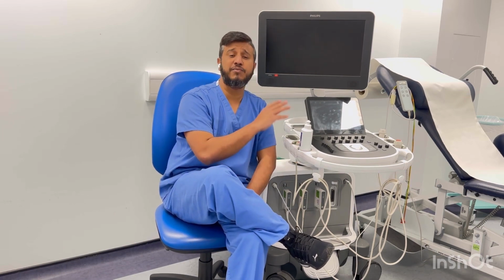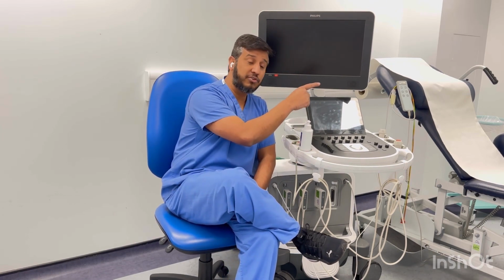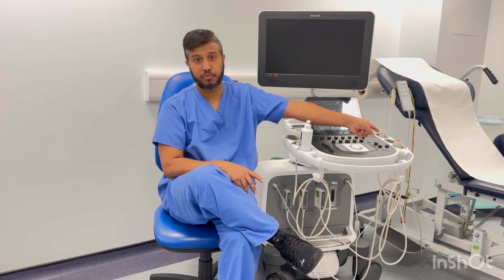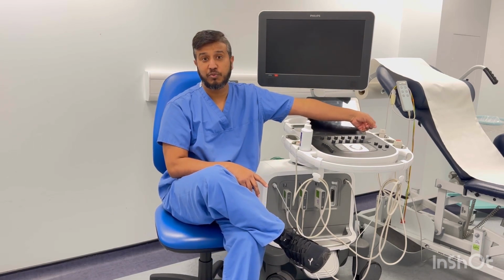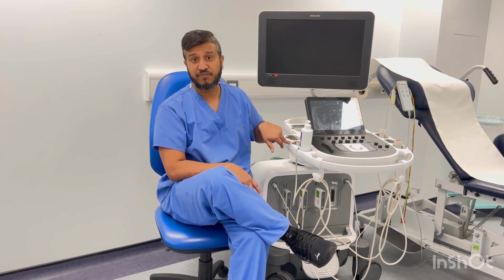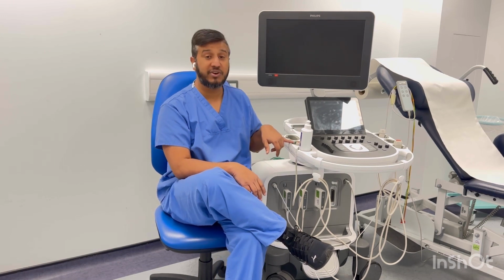If your patient is an adult, you are going to use the adult probe. This is a very simple thing. Once you come in and see your patient is an adult, you use the adult probe. If your patient is pediatric, you use the pediatric probe, and if it's an infant, you use the infant probe. And you will recognize the probe from the frequencies written up here.